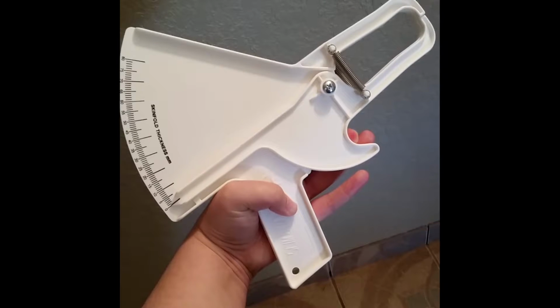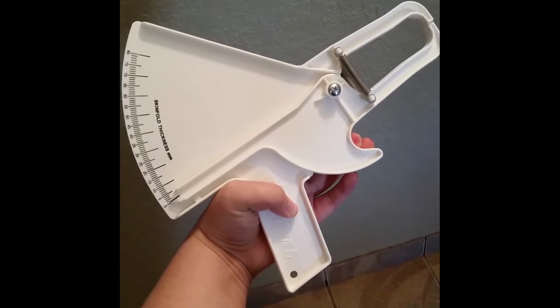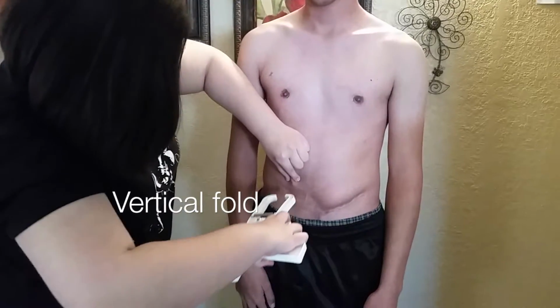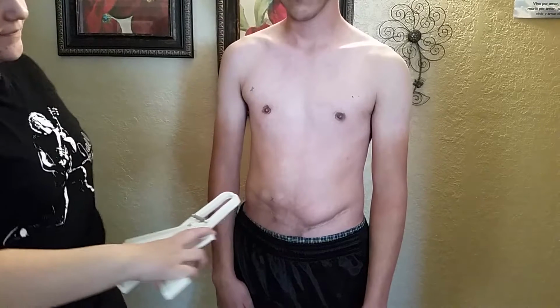We will be using a skin fold caliper. You want to make sure it is calibrated at 0. Let's begin. For the abdominal site, measure 2 centimeters to the right of the umbilicus. Mark your site with an X and perform a vertical fold. Place your caliper 1 centimeter away from your thumb and finger. Wait 1 to 2 seconds and record your measurement.